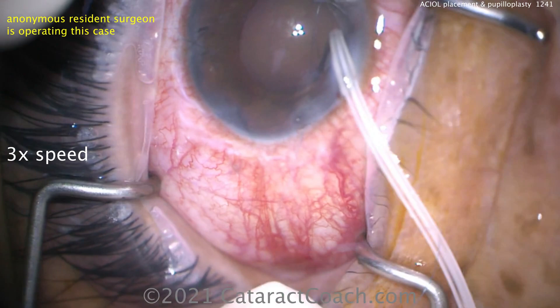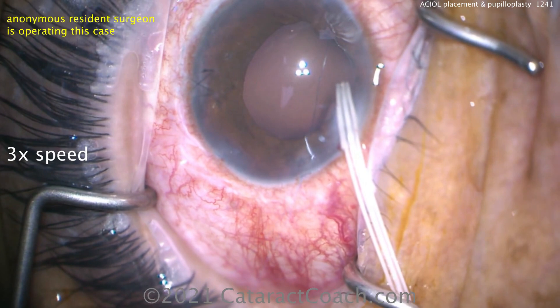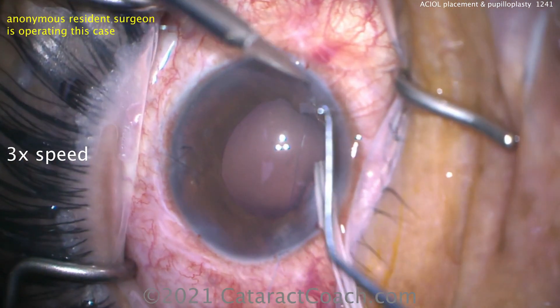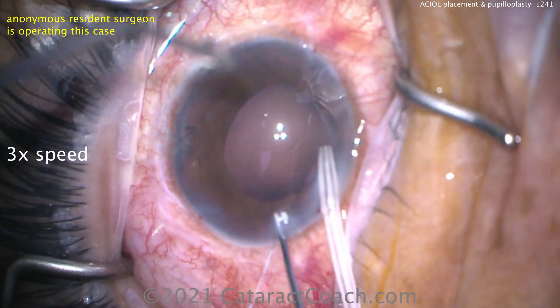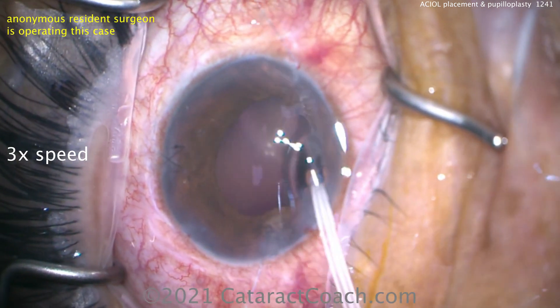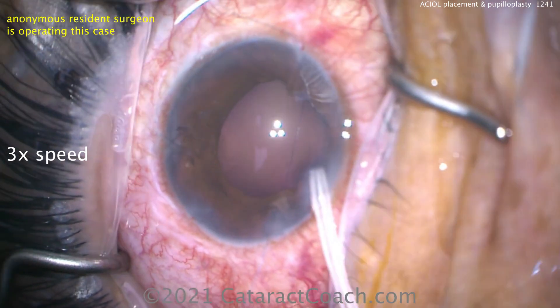Whoops — you just lost your AC maintainer. Put that back in the eye. Next time we may want to put that AC maintainer a little bit farther away from the area where we're operating. So instead of putting it inferiorly where the iris defect is, maybe next time put it in some other position. Now as we bring this out and do our forethrows, it's going to close that iris defect very nicely.